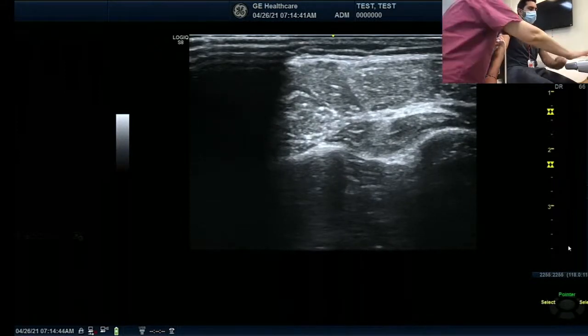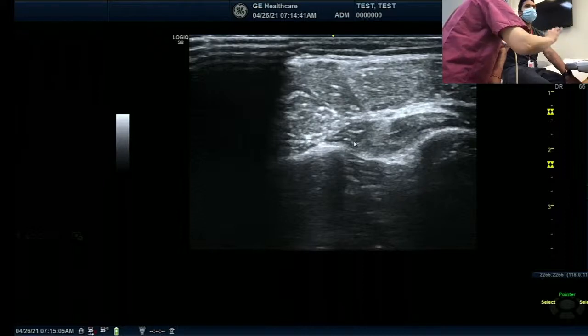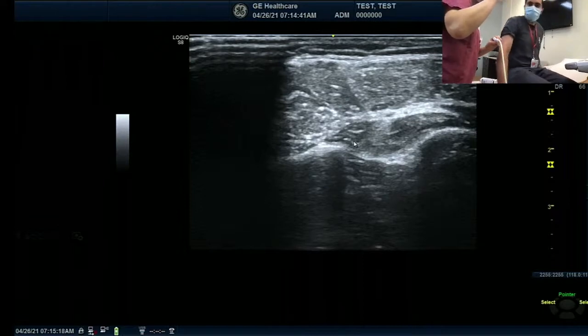Okay, so here, this is the EDC, extensor digitorum communis. The supinator is still there because you can see the radial nerve is here, right? But something is popping out in between the interosseous membrane and the radius and ulnar side. That's not the supinator. That's APL, abductor pollicis longus. Origin is what? Three places: radius, ulna, interosseous membrane. That's why initially when the deeper extensor muscle pops out, the first one is APL.